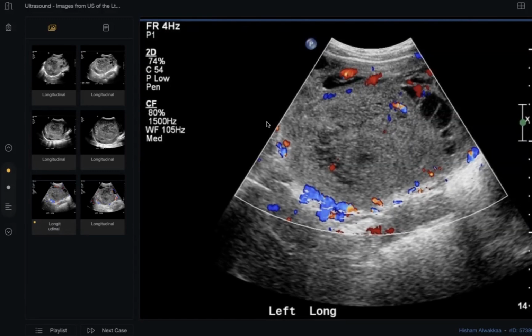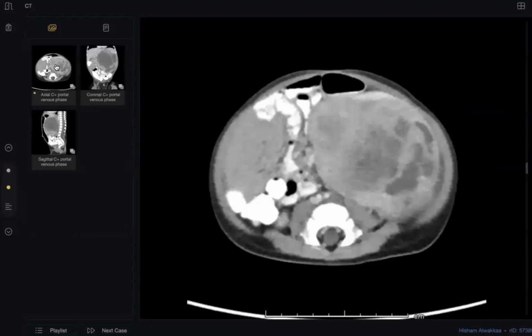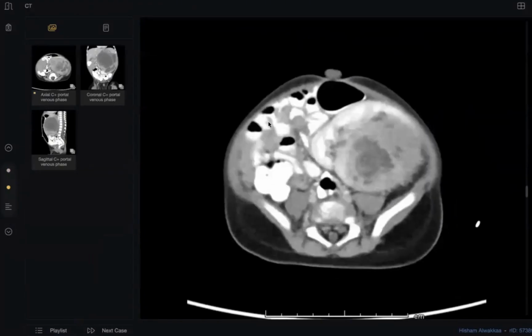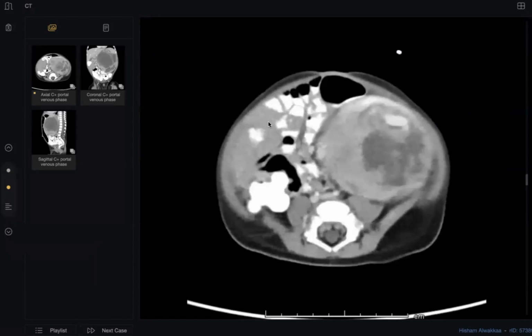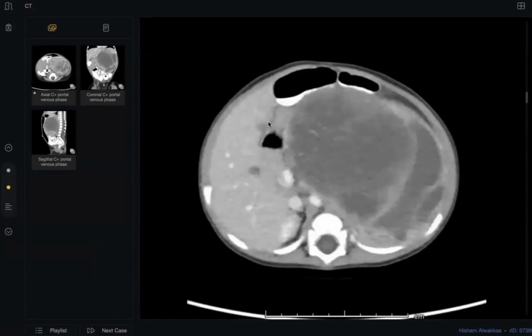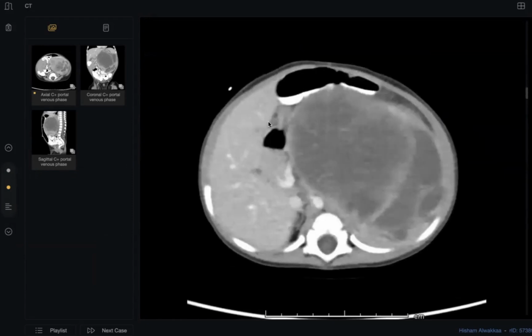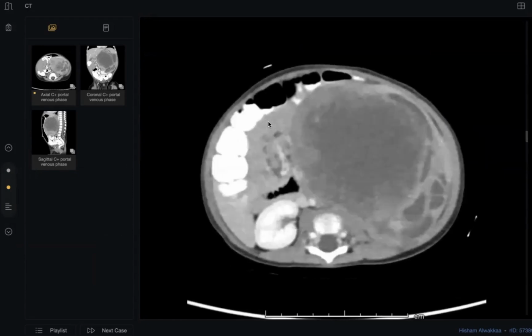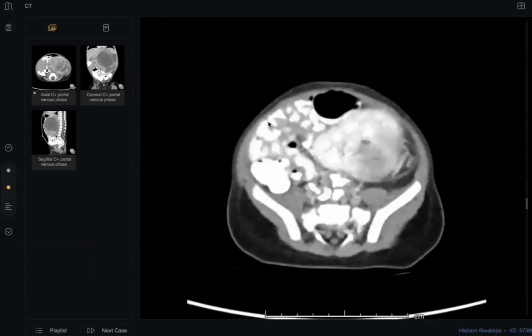My next step is to alert the referring physician, request a pediatric MDT, and request CT with contrast. Look, these are the same case of Wilms tumor, really very similar, but in very young age. Thank you, doctor, so much.